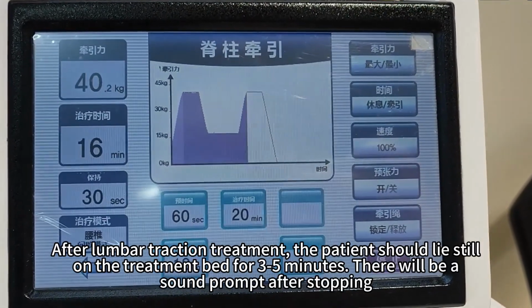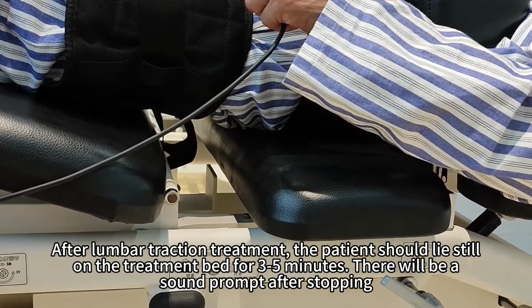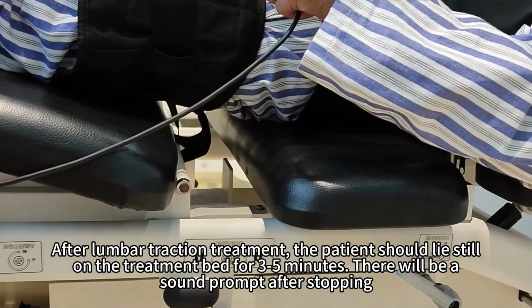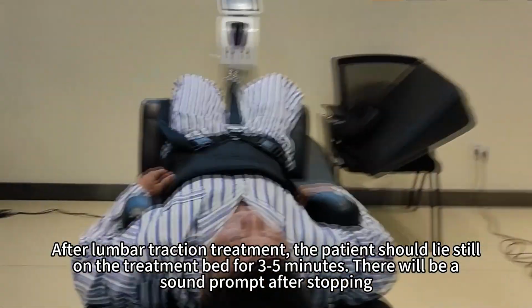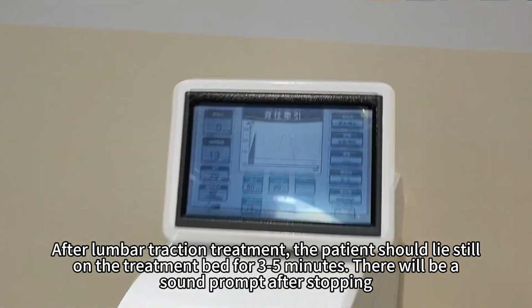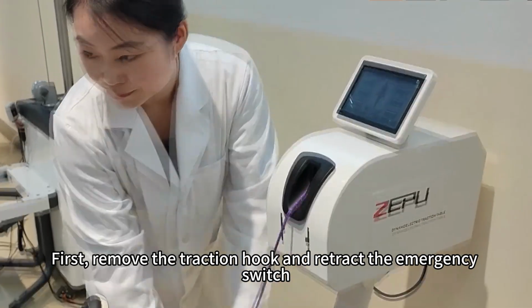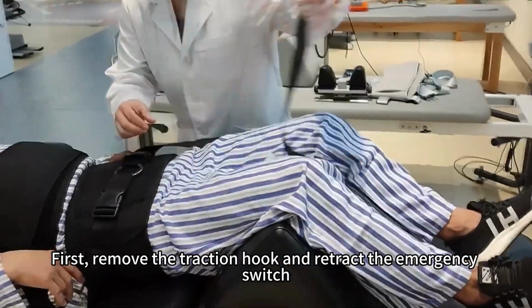After lumbar traction treatment, the patient should lie still on the treatment bed for 3 to 5 minutes. There will be a sound prompt after stopping. First, remove the traction hook and retract the emergency switch.